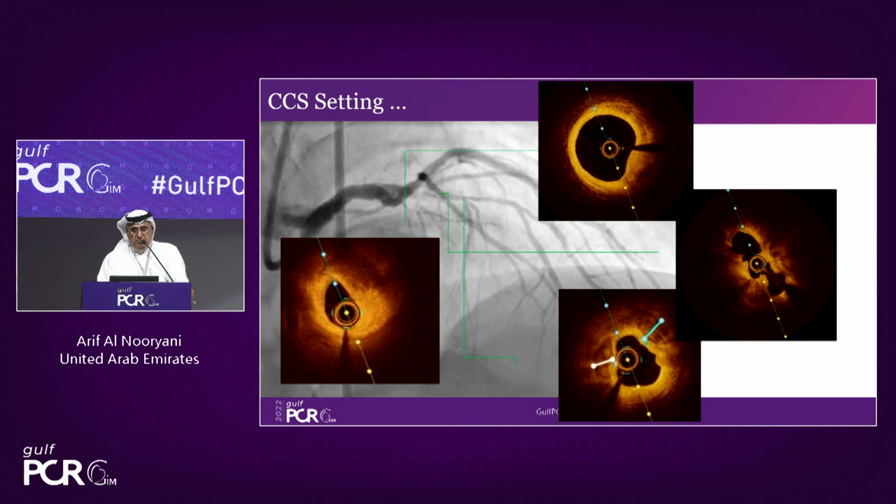Again, but maybe we had a better landing zone here after the diagonal. If you look at the angiogram in this image, you can see the diagonal also has disease, almost 60% proximally at the bifurcation. And that's also the beauty of calcium modification, that you preserve your side branches. We can see here the impact of rota.